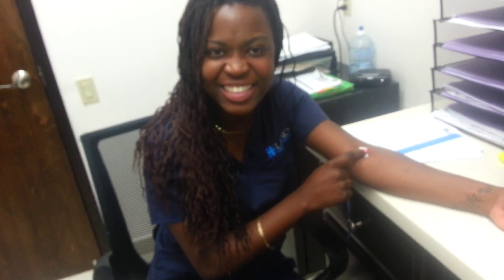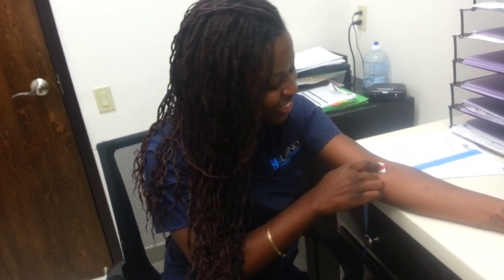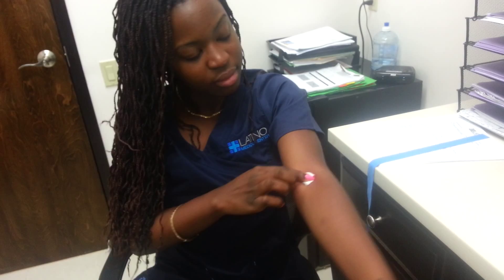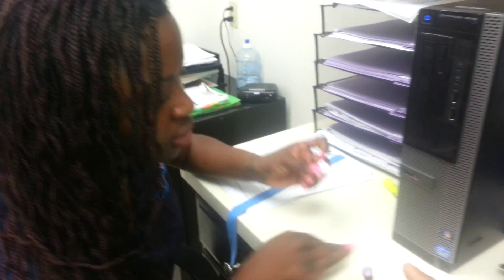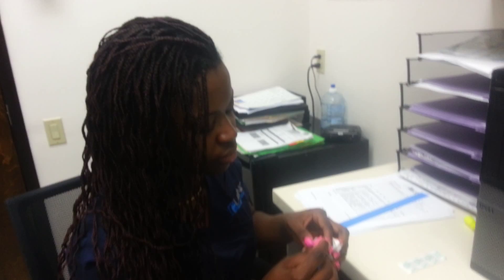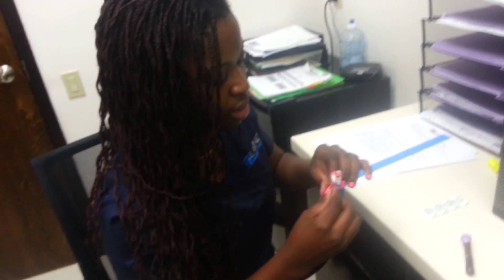Surprisingly, it didn't hurt. I was so excited to do it. We did it! Yes! I'm so proud of myself! Okay, now I need to apply my bandage. Where's my bandage? Right here. Let me apply my bandage so I can stop my bleeding.